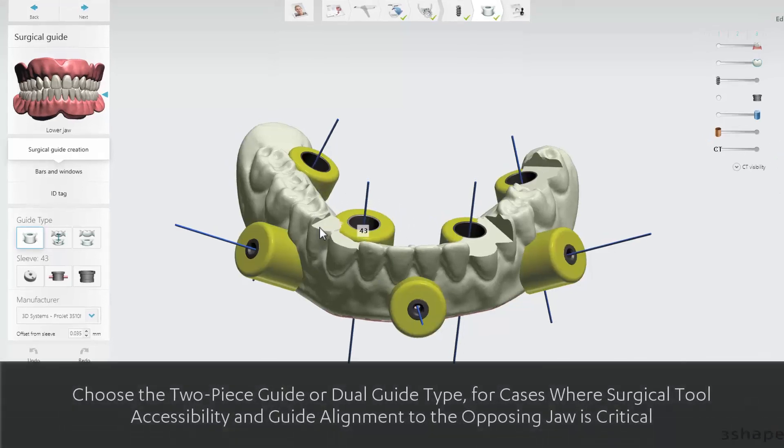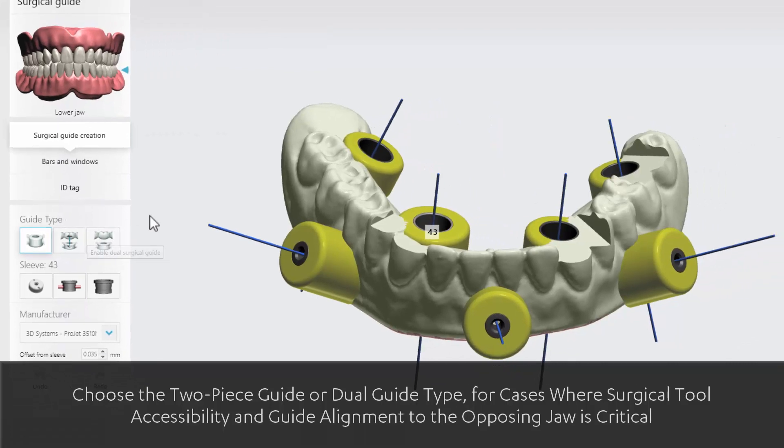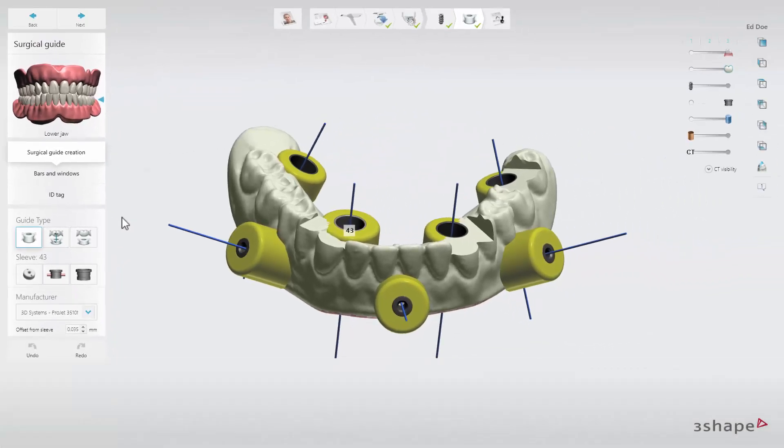You can choose between three guide types: a regular guide, a two-piece guide, and a dual guide. The regular guide has both anchor pins and normal sleeves included. You can use this for patients with a normal bite and mouth size.